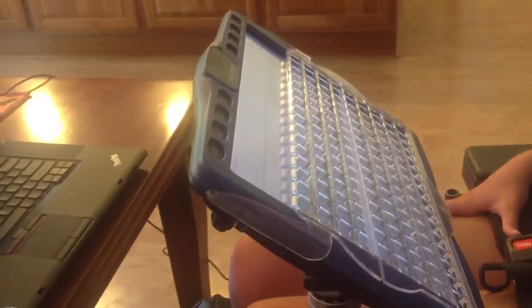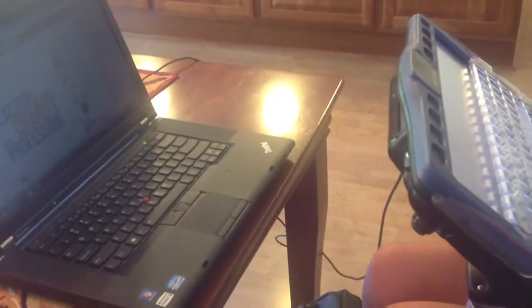So now she's got power, and that's how you do it. From there, Kate can pretty much take it. Sometimes she likes if you put her password in for her because it saves her strokes. That's it.